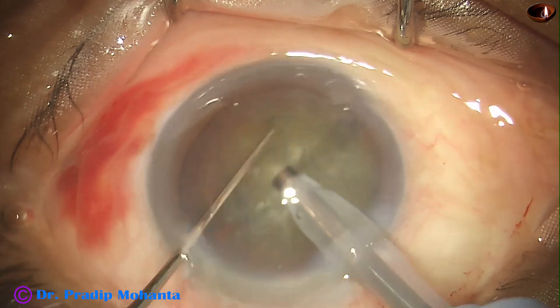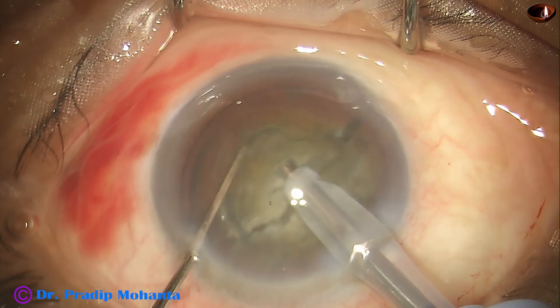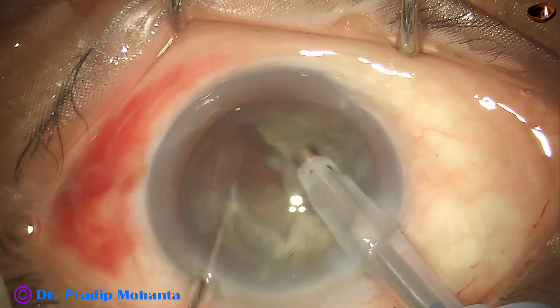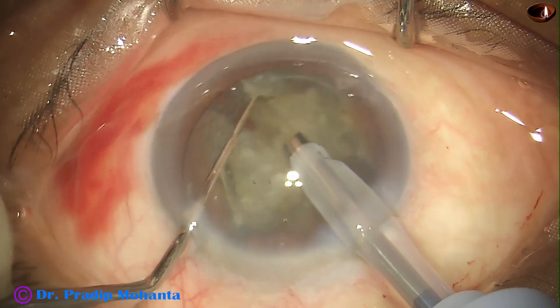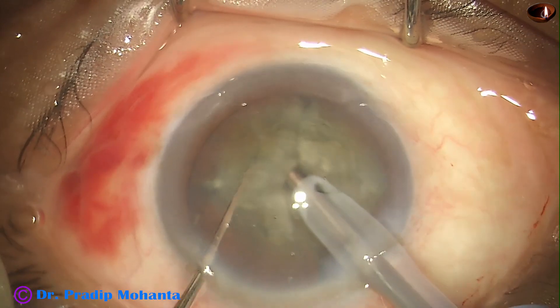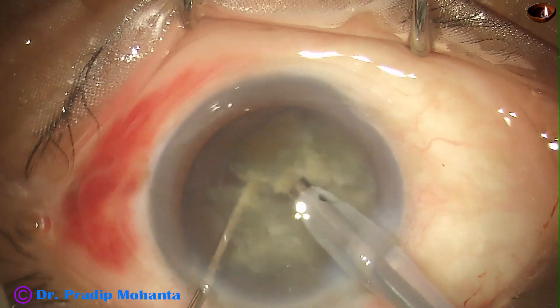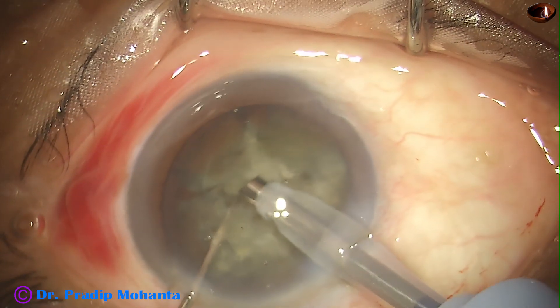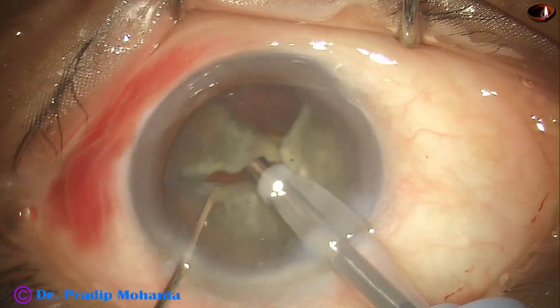Then I rotate, go to the other hemi-nucleus, go through the substance — the lens matter — hold it nicely and chop it. Each free nuclear fragment is again subdivided into two smaller parts, and then it is emulsified and removed.